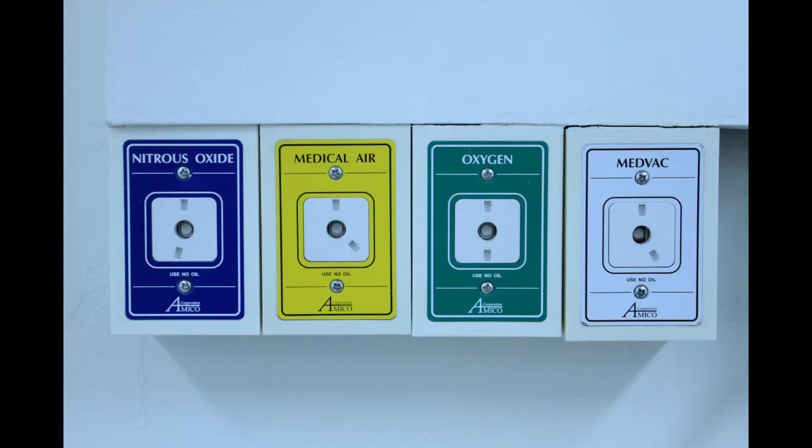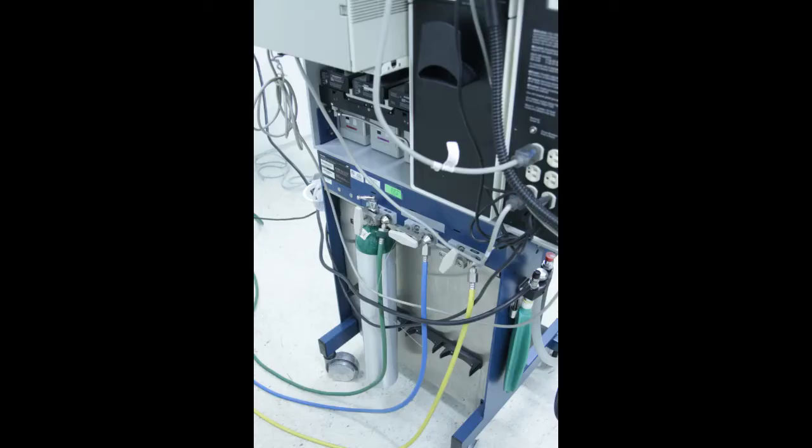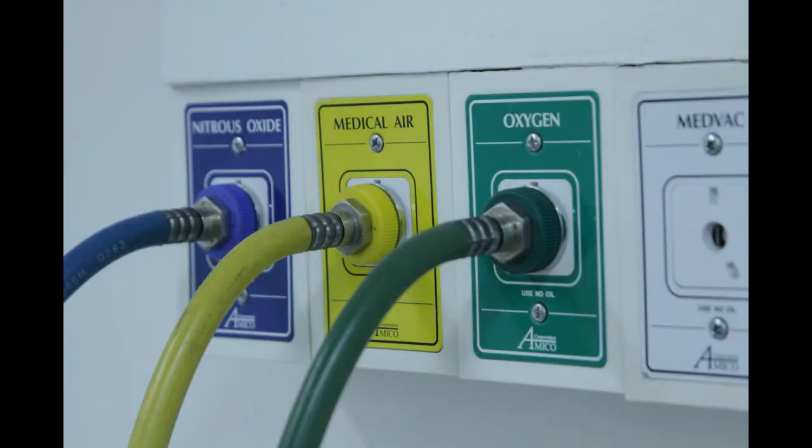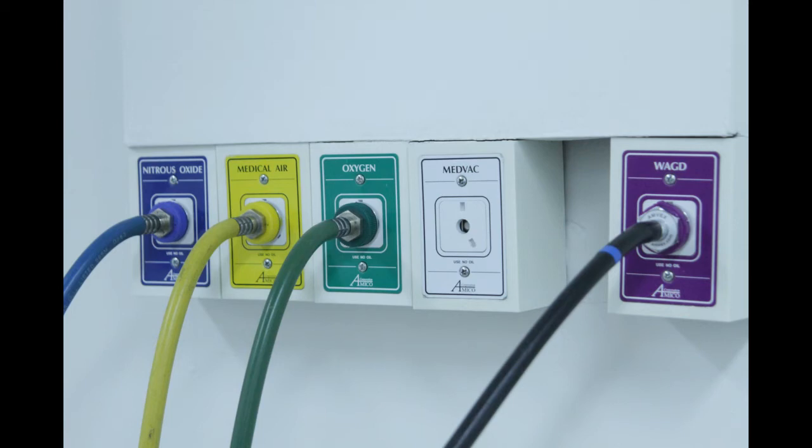There are two types of gas supplies: central supplies, also known as wall sources, and cylinders filled with compressed gas. Both typically consist of nitrous oxide, oxygen gas, and medical air, which is approximately 22% oxygen. Each of these is color coded. These colors differ between US and European standards, so areas that use equipment from both these regions may have both.